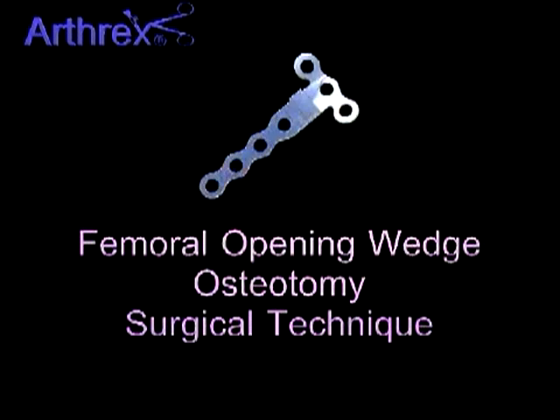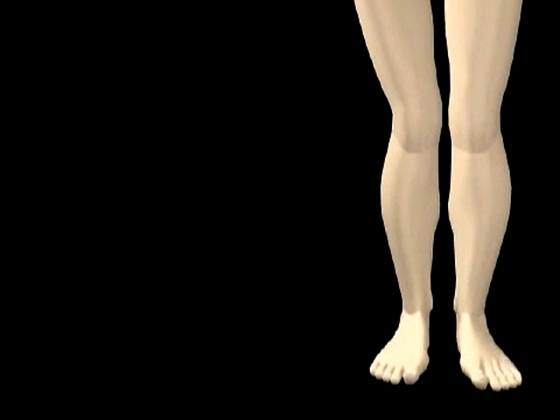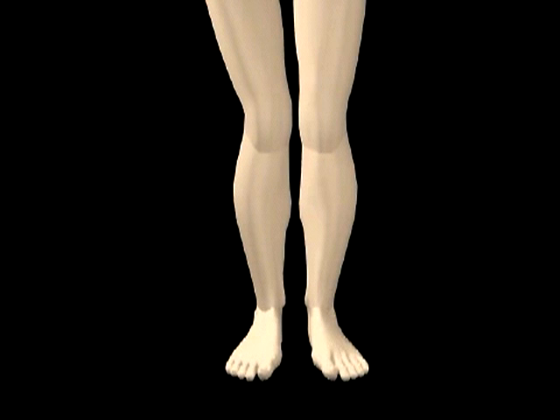The Arthrex Femoral Opening Wedge Osteotomy Surgical Technique. Preoperative evaluation, including standard 3-foot AP radiographs, Rosenberg, and Patella views are necessary to determine the amount of correction for the valgus-aligned leg. The degree of correction is calculated to restore normal physiological alignment.